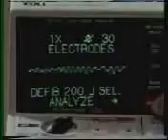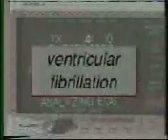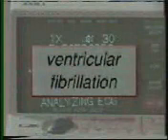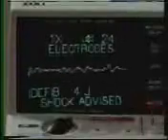Responding to a patient who has gone into cardiac arrest can be one of a healthcare provider's greatest challenges. A sustained perfusing cardiac rhythm must be established within minutes. CPR can maintain a patient for a short time, but in many cases, defibrillation is required to restore an organized rhythm. The most frequent rhythm disturbance in sudden cardiac arrest is ventricular fibrillation. In ventricular fibrillation, known as VFib, the heart's electrical energy is disorganized, preventing the heart from pumping blood. VFib can deteriorate into asystole, or no heartbeat at all, within minutes.